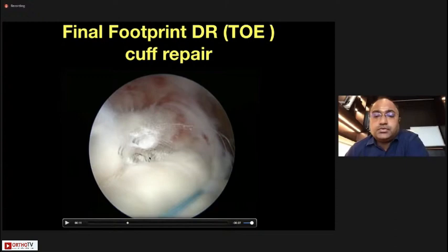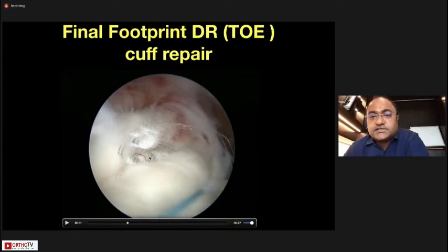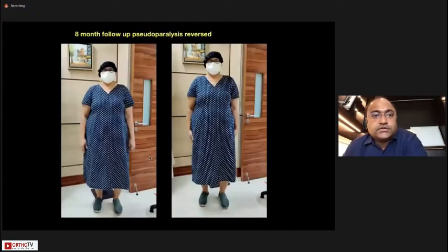The overall idea is: perform a thorough subacromial decompression, assess the tear pattern, prepare the tuberosities, place anchors right at the edge of the bone, use various devices to pass stitches through the cuff away from the muscle-tendon junction, repair the medial side, and only if you have a footprint low-tension repair should you proceed with a double-row repair.